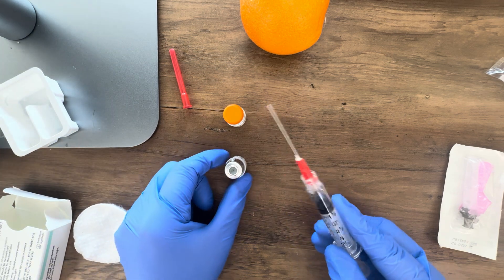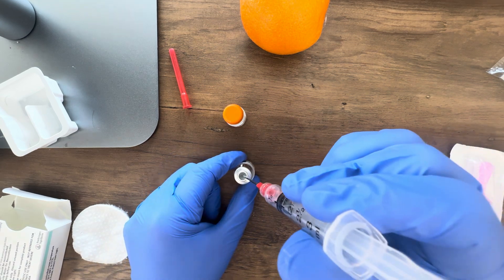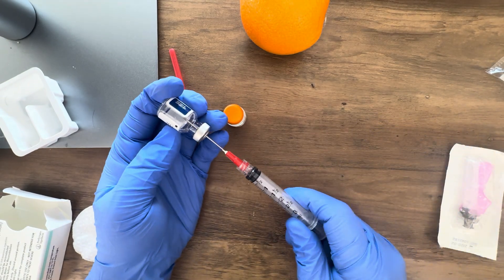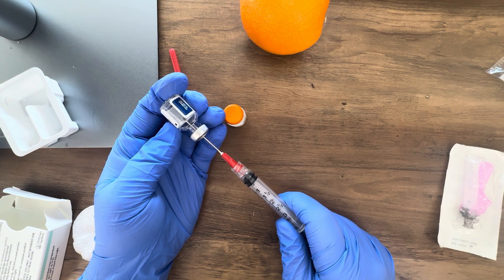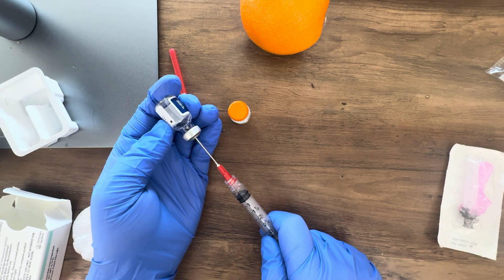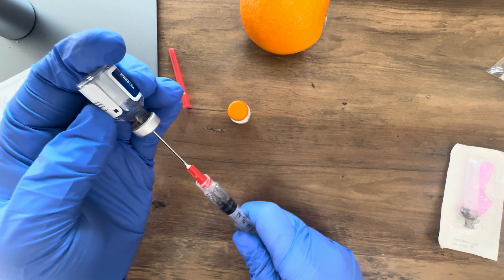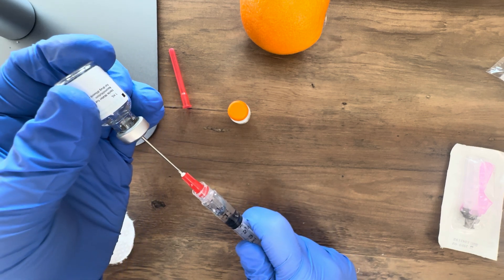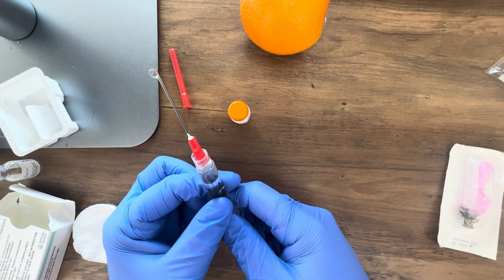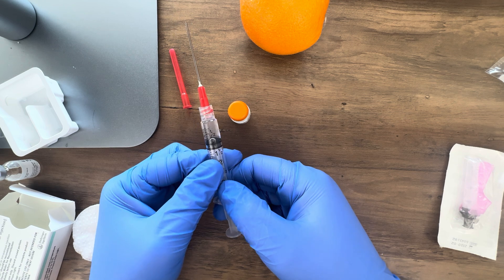I'm going to stab the rubber top with the needle. If you had previously taken the cap off the vial, you'll need to clean it with your alcohol prep pad. Once I've inserted my blunt tip fill needle, I'm going to push in the air and then flip the vial over. I'll move my needle down towards the end of the vial so it's in the liquid and I can draw the liquid up into my syringe. It should be about 1 ml — sometimes there is a little bit more. When I push the air out of the syringe I end up with 1 ml of liquid.